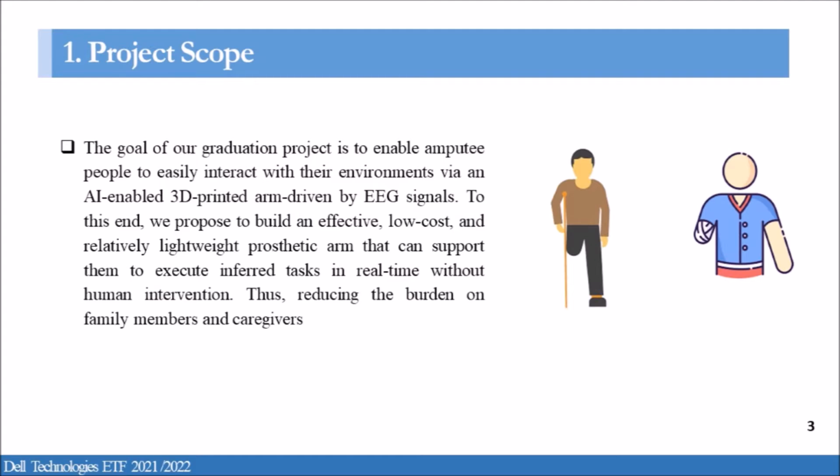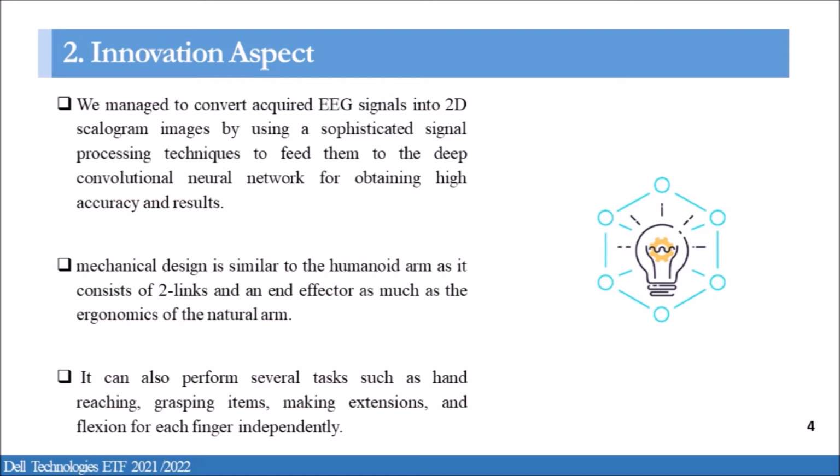For the innovation aspect, we managed to convert acquired EEG signal into 2D scalogram images by using sophisticated signal processing techniques and then feed it to a pre-trained neural network to get high accuracy and results.